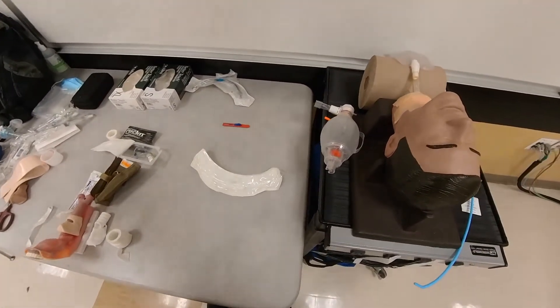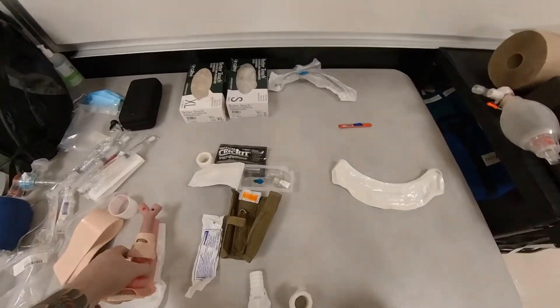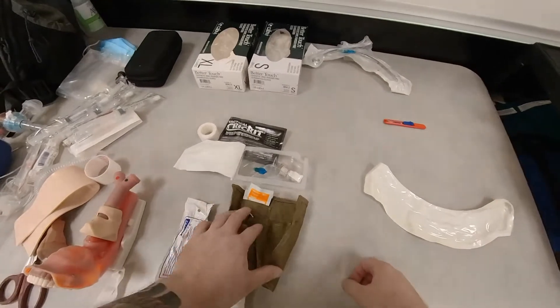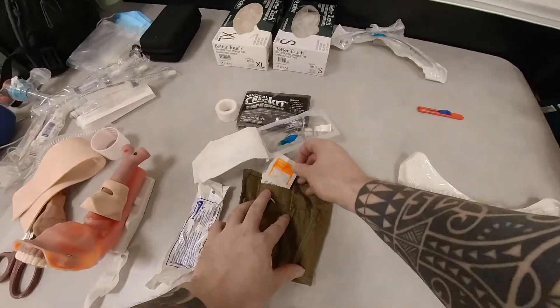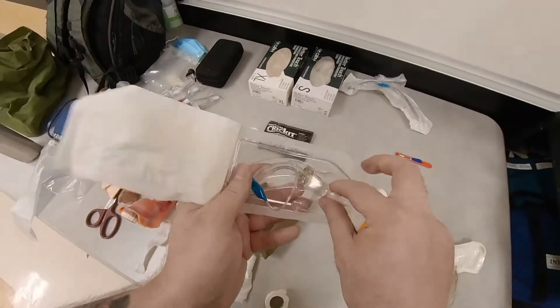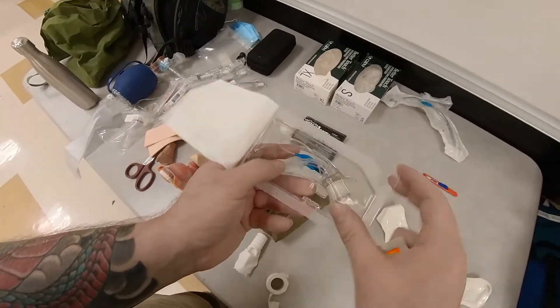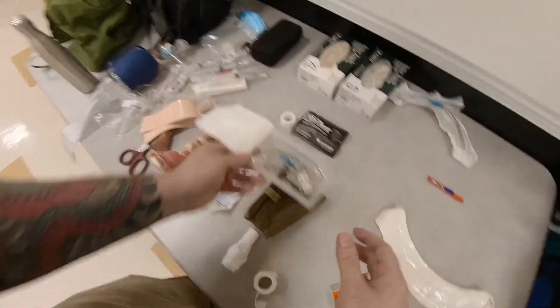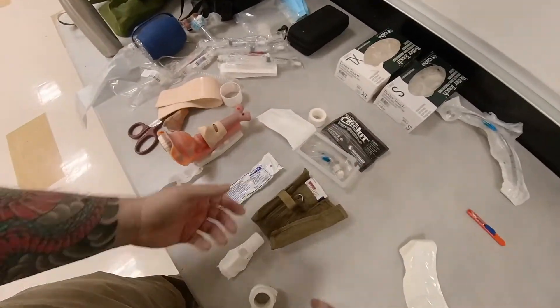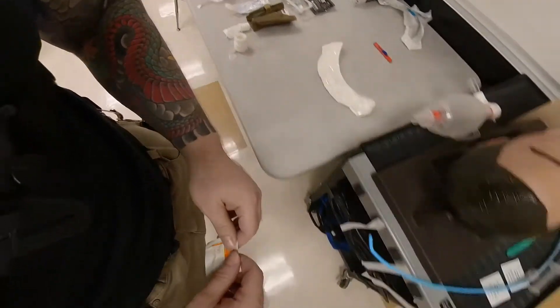I'm going to use the 6.0 endotracheal tube. I'll briefly show you this quick cric kit — it already has everything you need: cleaning solution, alcohol, betadine, and a cric that's already sized so you can employ that device. However, you may not always have this with you — this is a tactical cric kit. So for this procedure, we're going to use the 6.0 endotracheal tube.